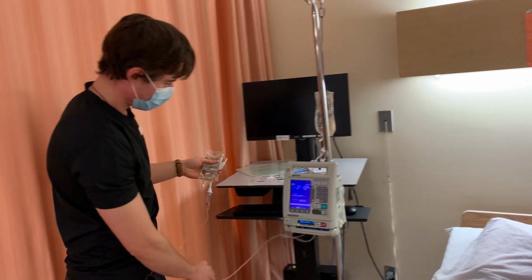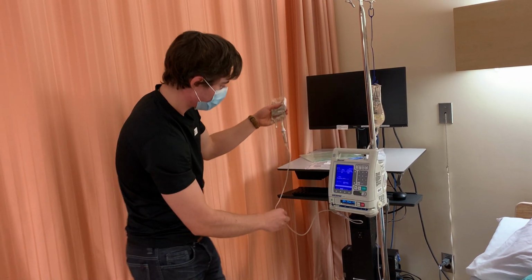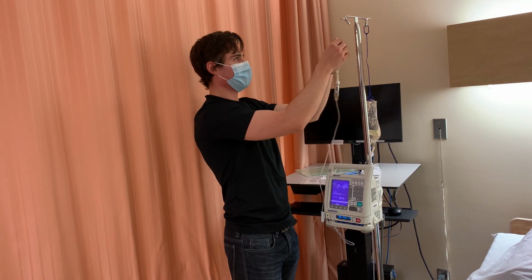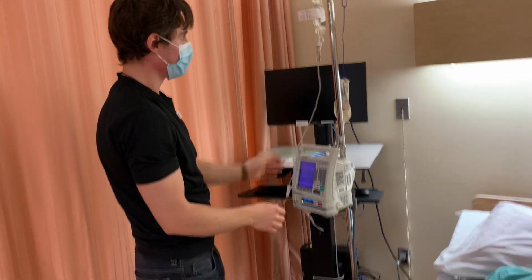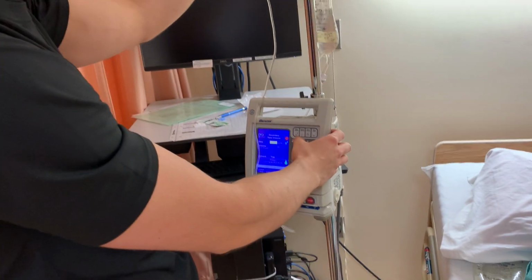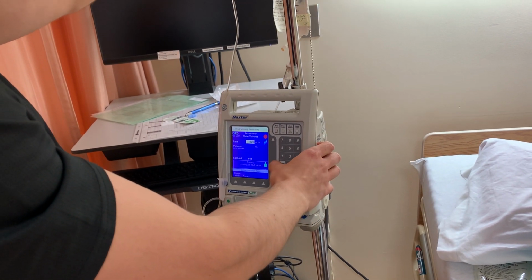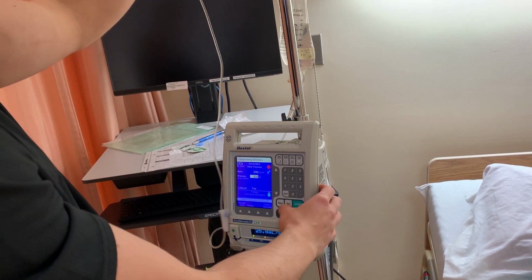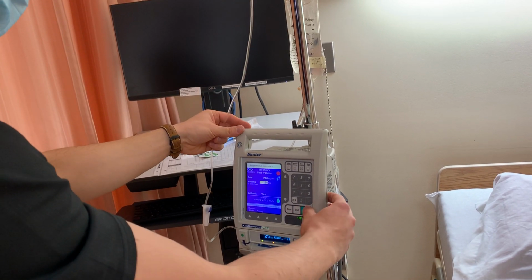After that, I'm going to open up our clamp and back prime, make sure that all the bubbles are out. So once I'm sure that all the bubbles are out, I'm going to make sure that our drip chamber is filled to the appropriate level, which is about half. Hang that there. I'm going to then program into our pump here. So our secondary, it's going to be at a rate of 220 mLs per hour for a volume of 110.